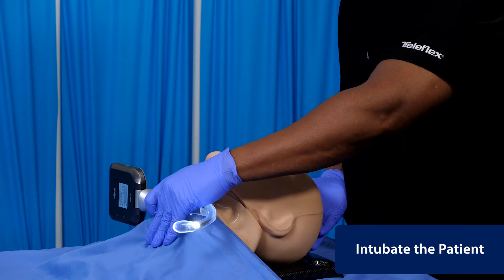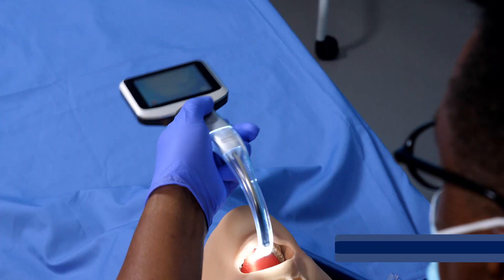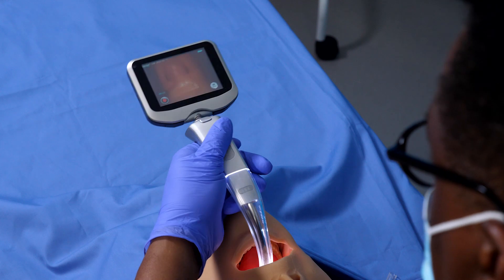To intubate, stabilize the patient's head. Look in the patient's mouth and insert the video laryngoscope from the midline passing the root of the tongue.